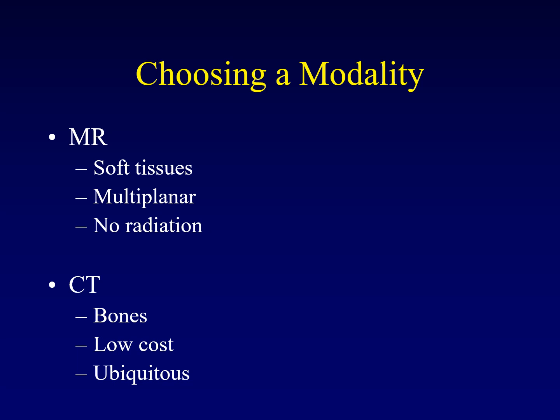As we discussed earlier, MRI has a multiplanar advantage, CT restricted to a transverse plane. And MRI has an advantage of no damaging radiation. Radiofrequency pulses are radiation, strictly speaking, but they are benign. There is no harm to the patient to get an MRI. MRIs are so safe, we stick pregnant women in all the time. Super safe examination.